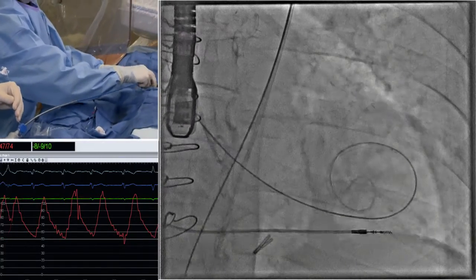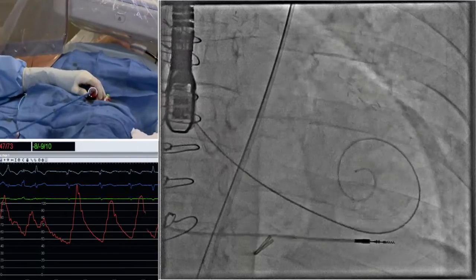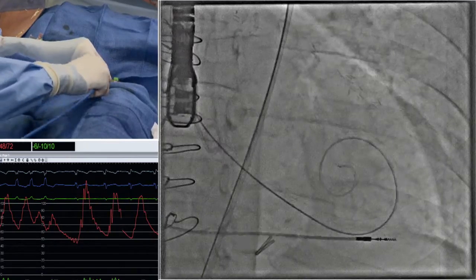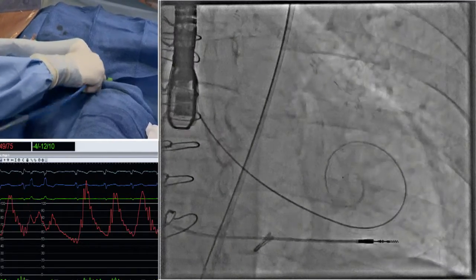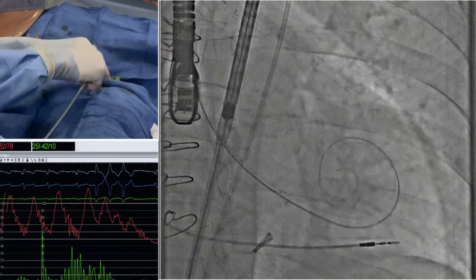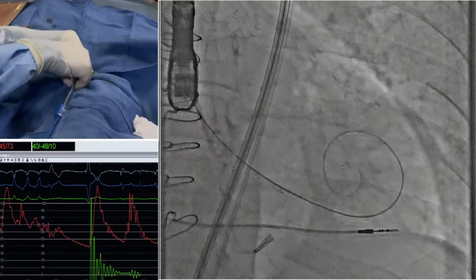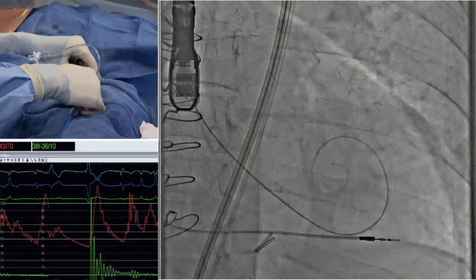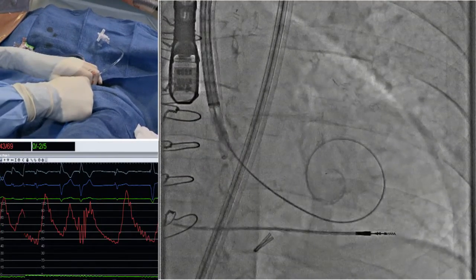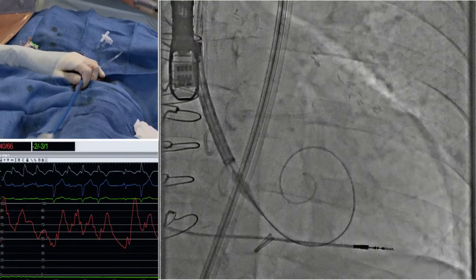I think, unfortunately, Dr. Cartier doesn't have the mic at the moment. We had a bit of trouble with the AV, but when we discussed this previously, one of the very encouraging parts of this was that there was no intramural thrombus in the aneurysm itself. So we were just trying, from the point of view of just sheer stress of our wires on the aneurysm, as I said, we chose the left-sided approach. But no one really thought it would be absolutely contraindicated to just do a transfemoral approach, unless the panel had other thoughts.